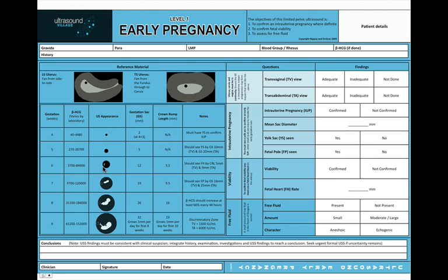Okay, so we're up at 6 weeks. We've got the yolk sac, little fetal pole. Again, with more of those notes, the things I've just gone through about when we should see a fetal heart, when we should see a fetal pole.